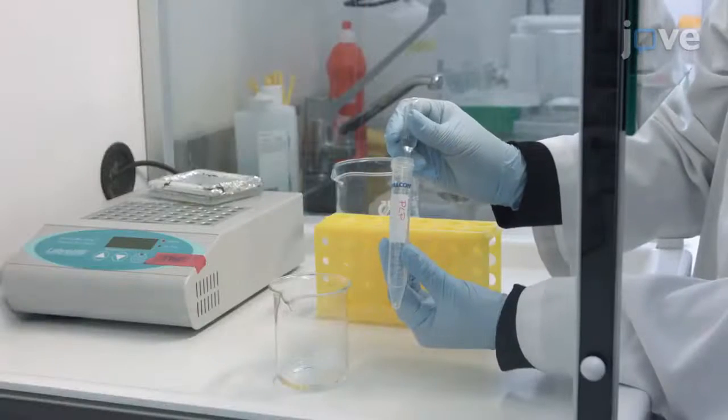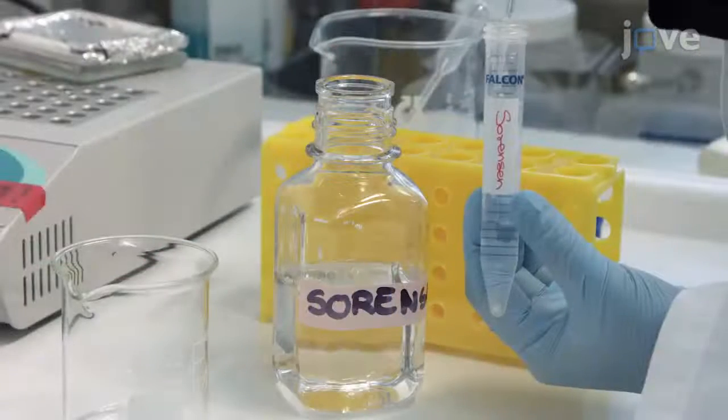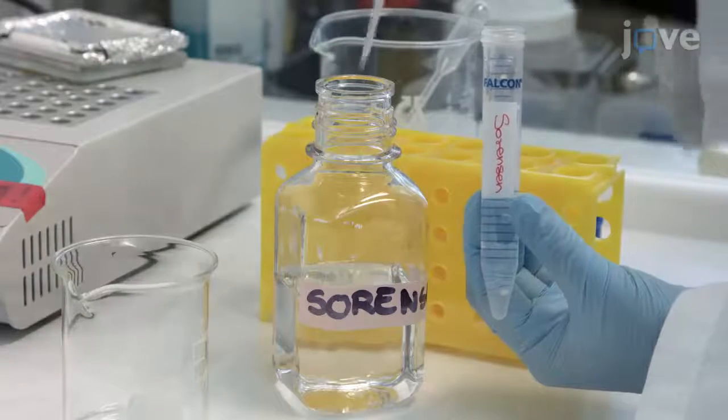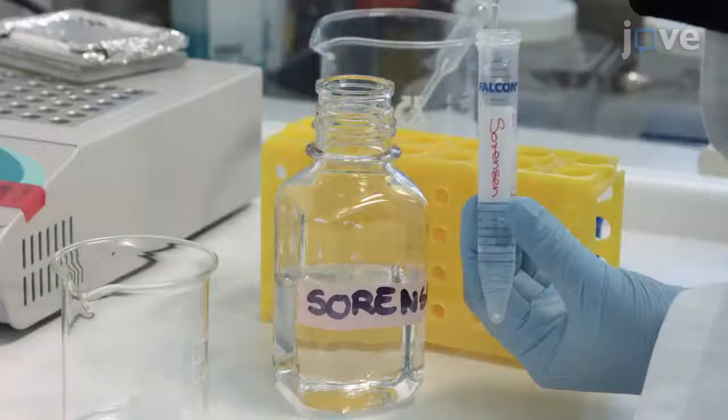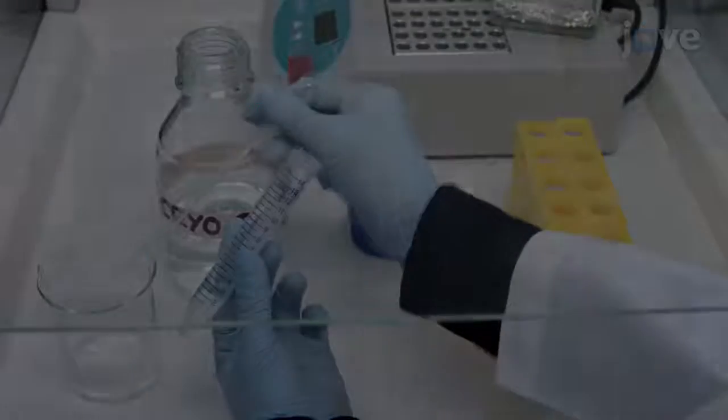The next day, in a fume hood, remove the PLP fixative gently. In the same tube, wash the biopsy 3 times for 5 minutes each, using 5 milliliters of 0.1 molar Sorensen solution for each wash. Discard the Sorensen solution.